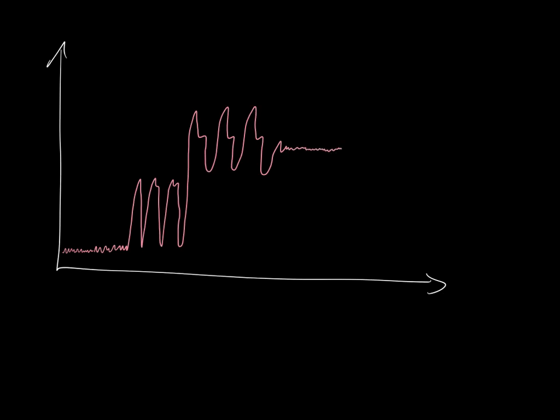Wedge. Okay, so where should we normally be when we're not doing anything with the pulmonary artery catheter? What should it normally look like? Yeah, I should have a normal pulmonary artery pressure. If this happens during transport, inadvertent wedge, how do we correct that? What do we need to do?